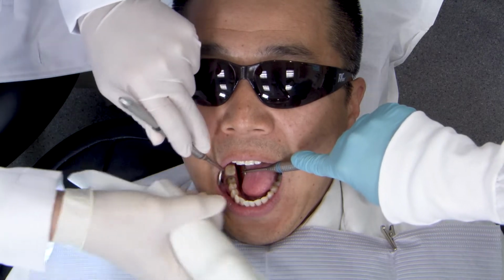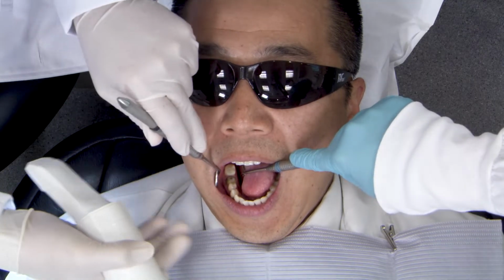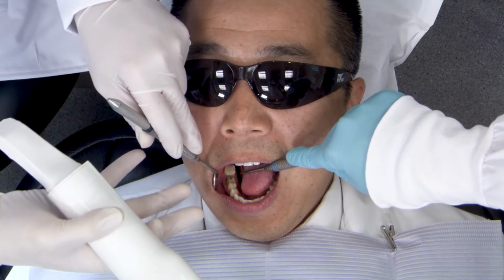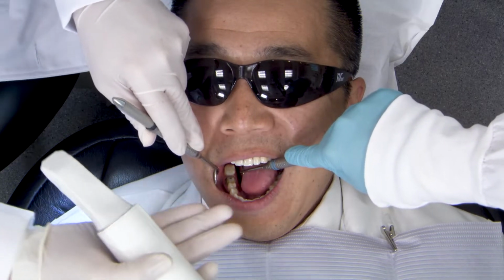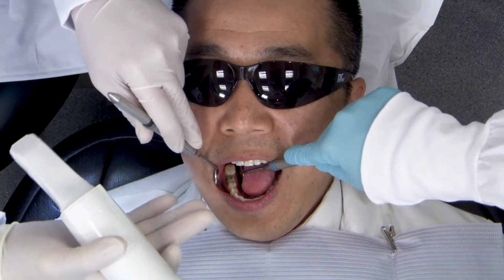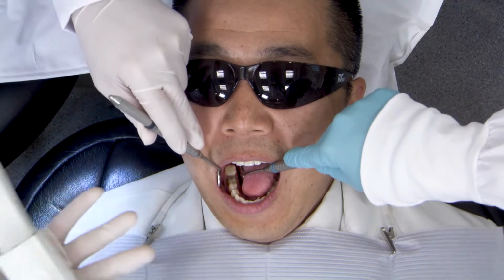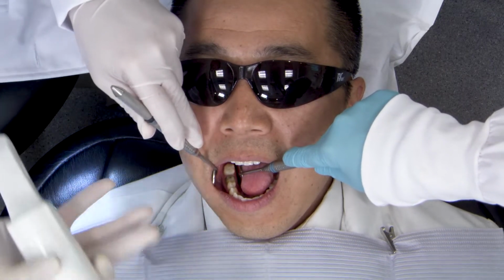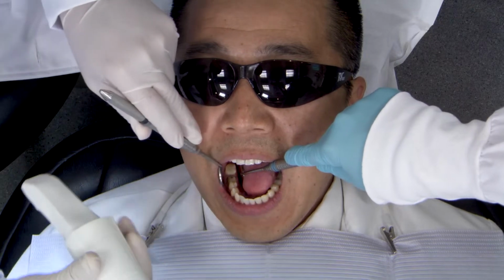Here I'm using a mirror on the buccal side to help keep the cheek out of the way. Now, having the soft tissue, keeping tabs on that, where the tongue and the cheek are, the lips during the scan, is going to be very important. So we want to try to keep those away from the area that we're scanning, because the focus will be the teeth and the soft tissue around them.